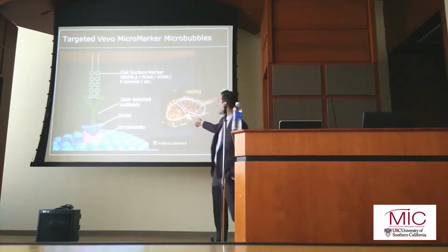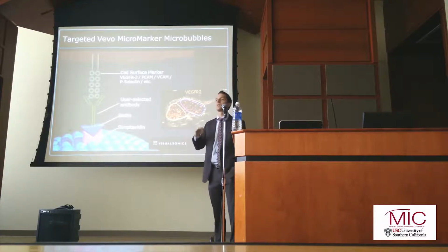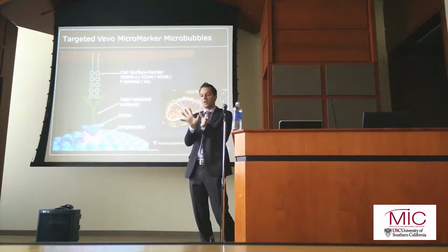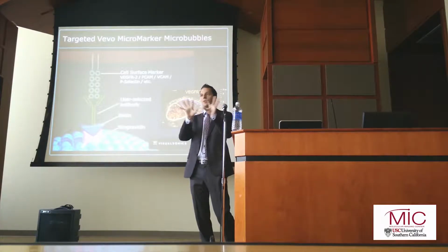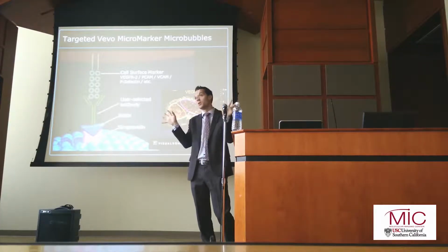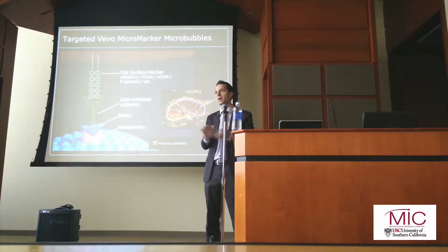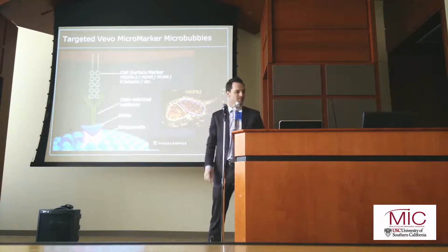and I don't think you can really say, okay, there's X number of receptors. There's a lot of things going on here. How many bubbles can you fit together versus the receptors? The bubbles are huge relative to the receptor expression. So how many bubbles can you fit within a certain area? But I can certainly look up some references and find that for you.